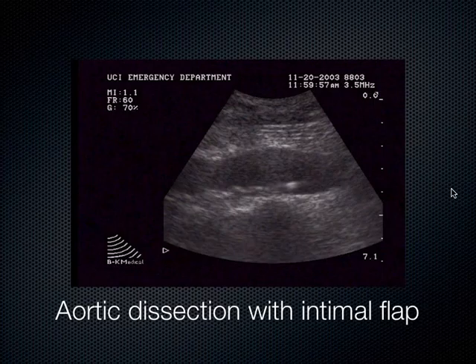If the intimal flap separates away from the rest of the wall of the aorta, blood can come right down in between this intimal flap and the outside wall and push this intimal flap even more anteriorly, and eventually you can occlude the flow of blood down the aorta. And that's an aortic dissection. Different than an aneurysm, right? The aneurysm was that giant structure. The dissection is this flap that comes off.